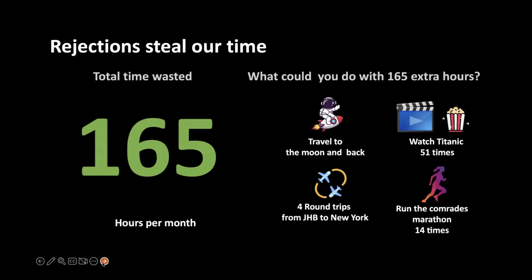So if we estimate that, just for argument's sake, each rejection between the laboratory receiving office and the clinical side of things takes up around 30 minutes to resolve, including both repeating the sample and sending out communication that it was rejected, then in May alone, we wasted about 165 hours.